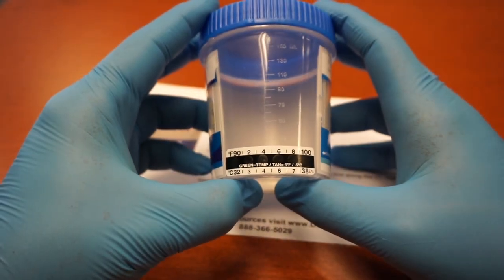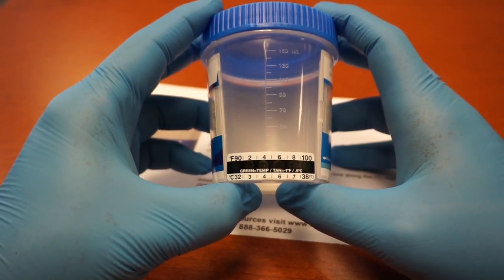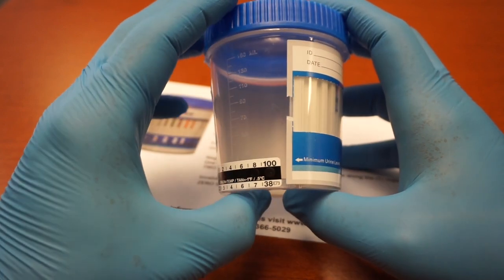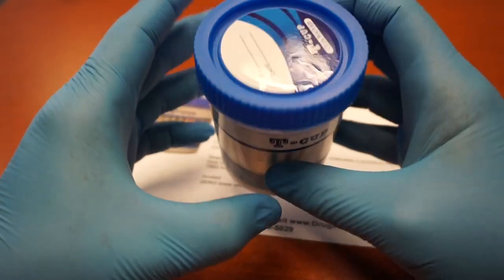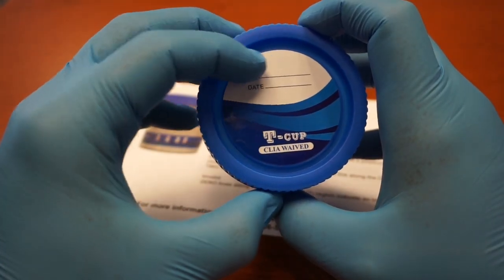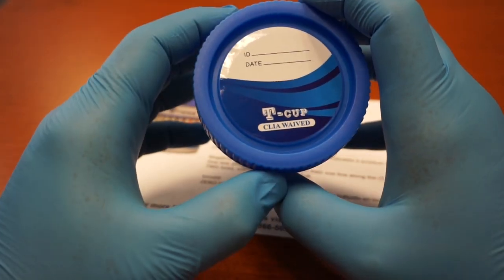On the back of the cup is a temperature gauge to make sure that the urine is at the correct temperature when it was submitted. At the top of the cup, you have the option of putting the donor's name and the date that the test was taken.